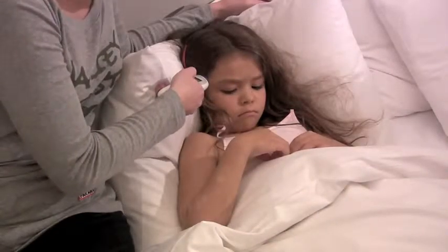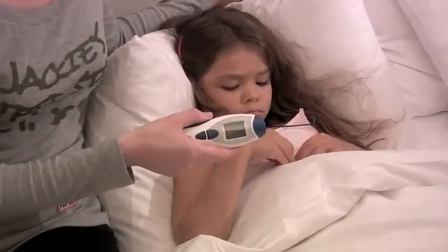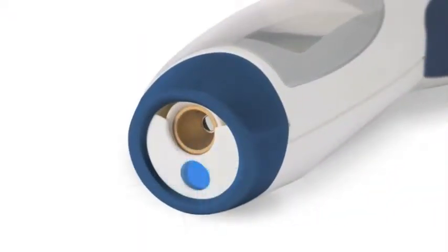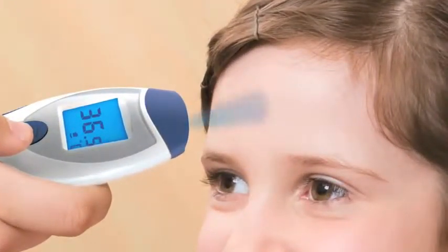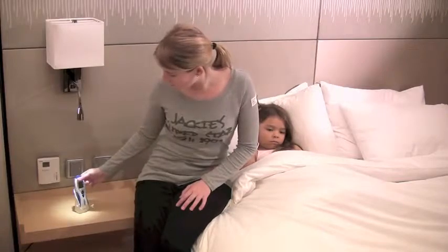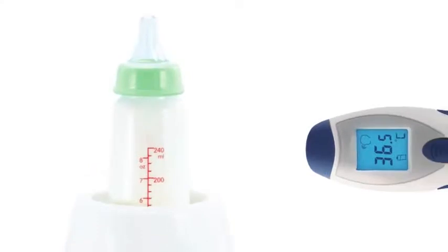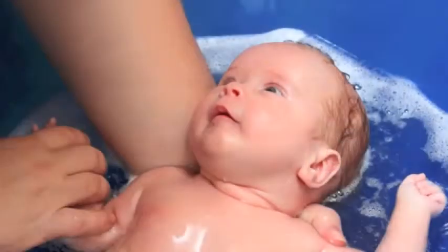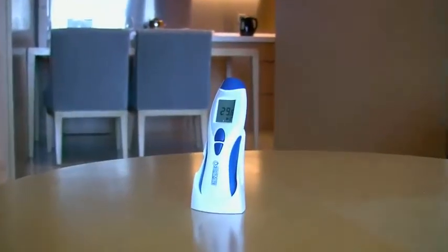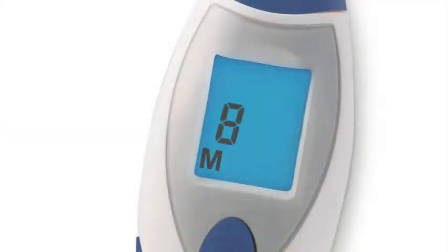Take your temperature from your forehead in just one second using Brahmat BD-1500 no-contact thermometer, with the unique blue beam technology to easily target the measurement area for the most accurate reading. Suitable in particular for children, it quickly and comfortably measures body temperature, as well as surface temperature — for example, a baby bottle or a baby bath — and automatically switches to room temperature mode once in standby.